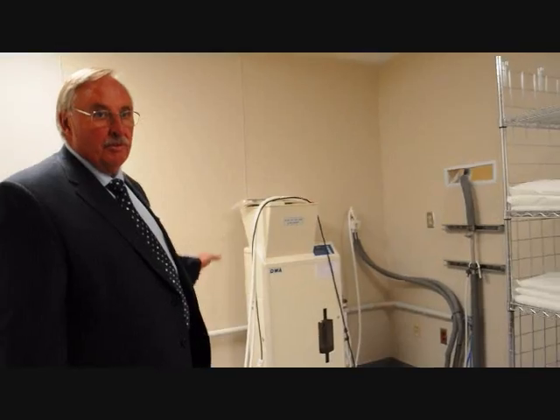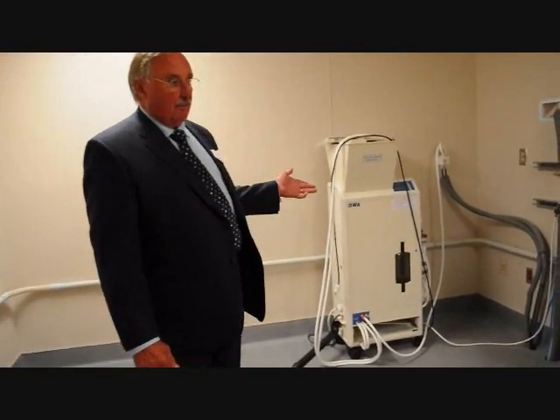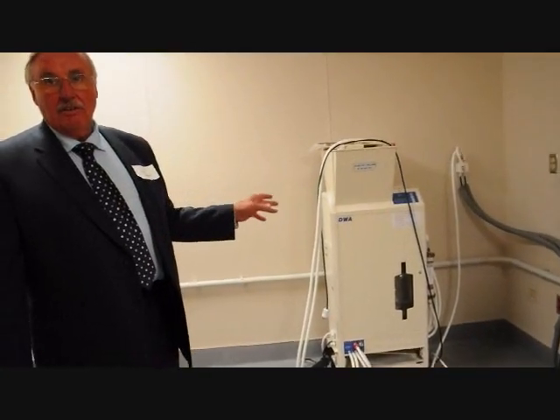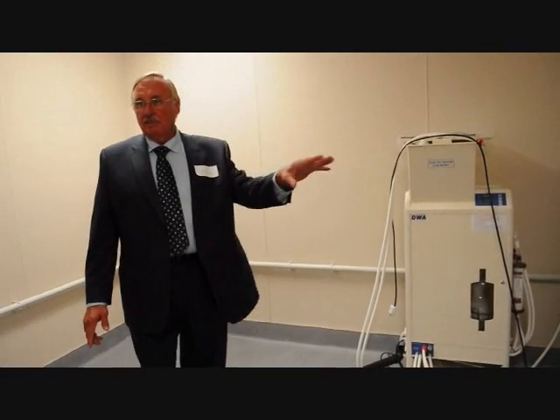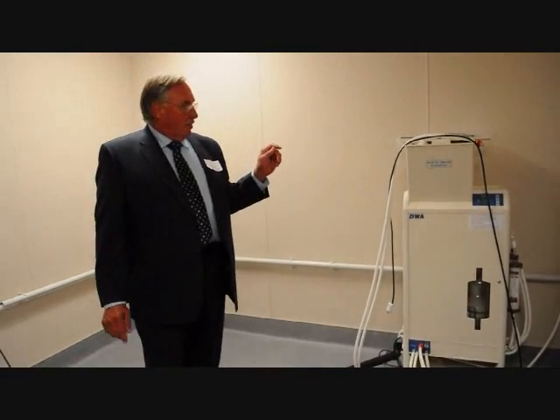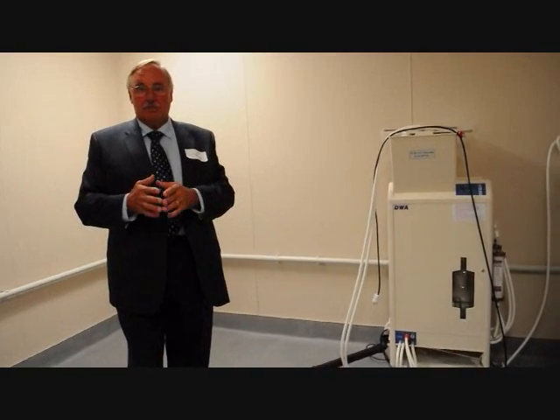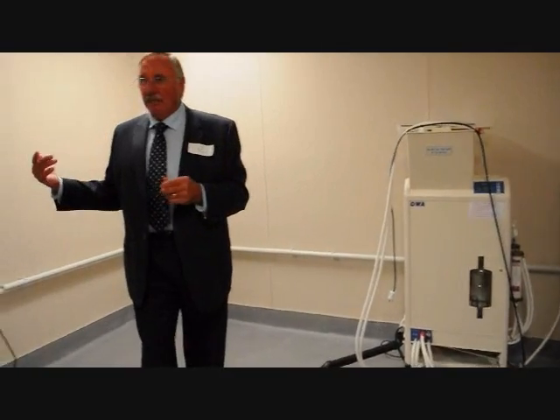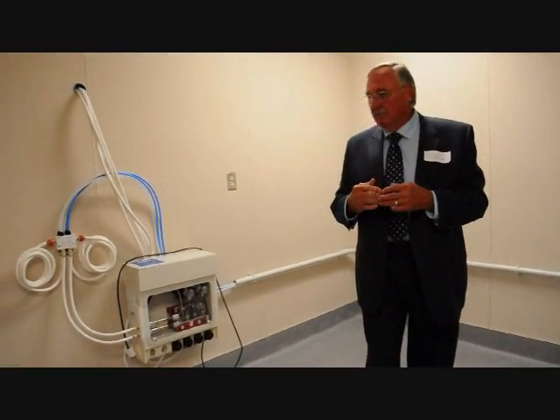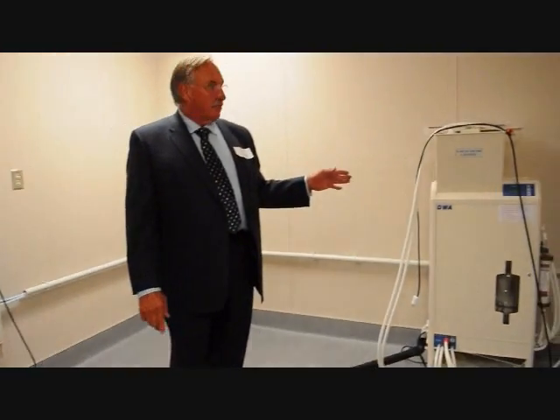Okay, after the water treatment room, these are two other pieces of machinery that we'll just go over. They are, again, the state-of-the-art in chemical distribution to the dialysis bed heads. In dialysis, you need two other chemicals other than water, and they are mixed with the water in the dialysis machine. One is bicarbonate, and the other one is acid. It's actually a potassium acid. So we'll start with the bicarbonate machine.